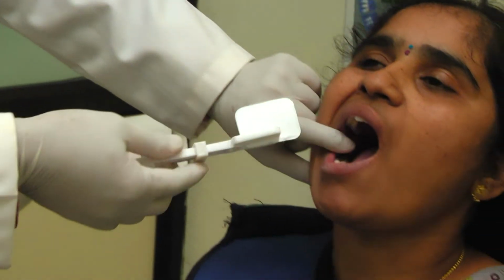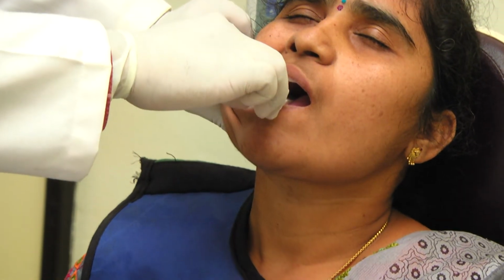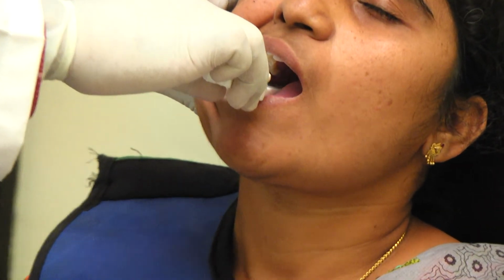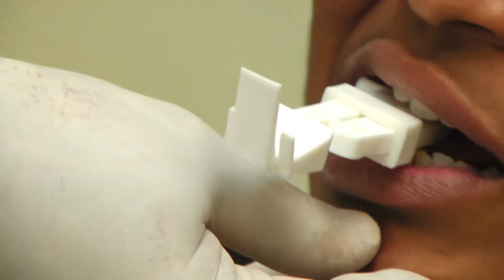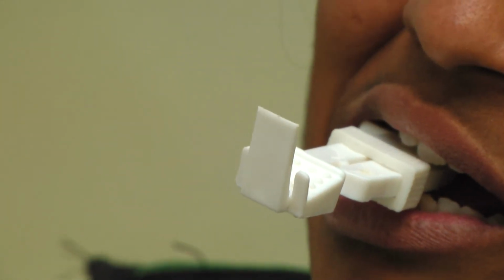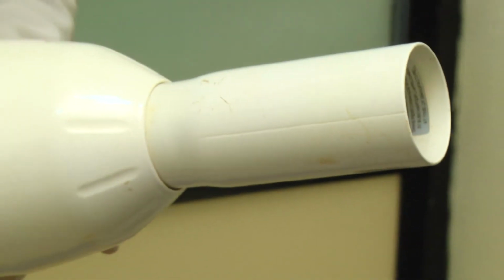And for mandibular molars, the same placement again, and see to it that the molars are exactly in the center of the film. Once it is properly positioned, ask the patient to bite and then adjust the height. The vertical angulation for mandibular molar is minus 5 degrees.